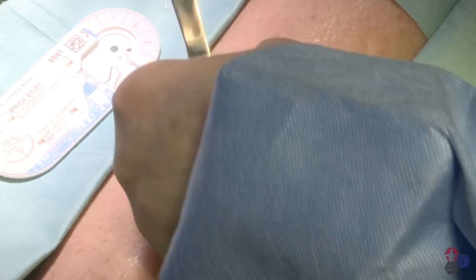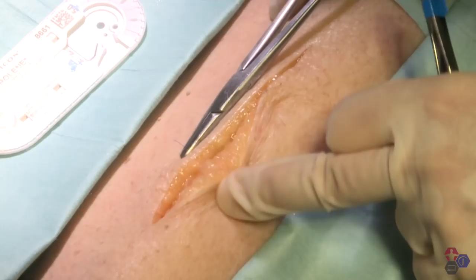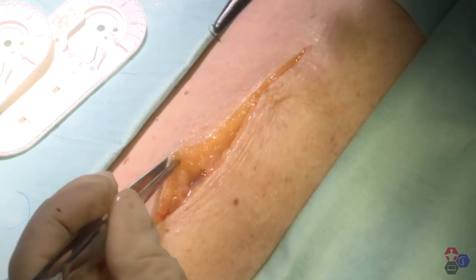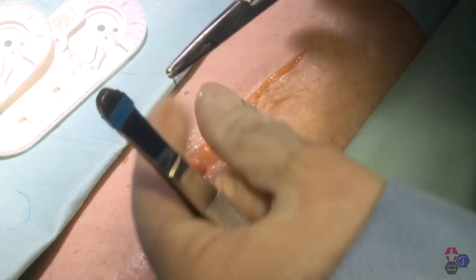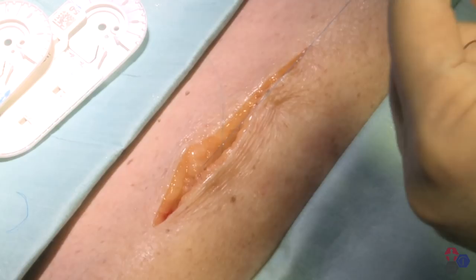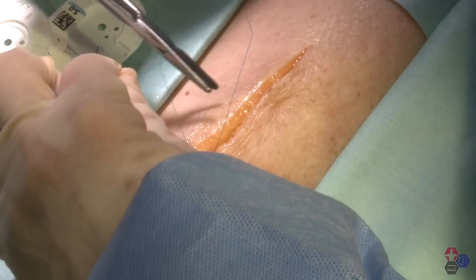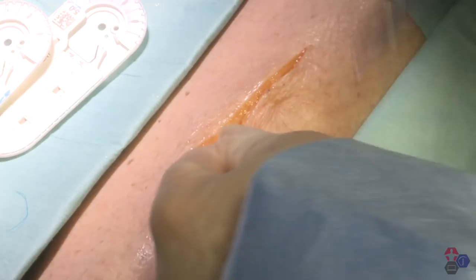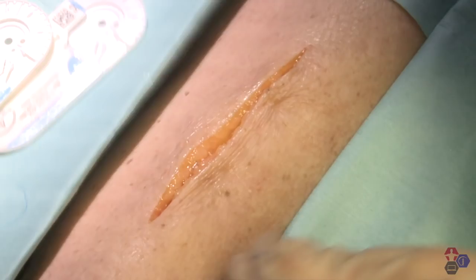You only need three throws on this. Cut the suture on top of that knot, and you can see it's already re-approximated the subcutaneous tissue. I would probably put another one in this location here. I'm going to close this space over here — start deep, come out superficial. Don't buttonhole the epidermis. Superficial to deep, keeping it all on the same side of the tie. Do our surgeon's knot, pulling those deep spaces together. Reverse locking stitch, one more for good measure. Once the knot is buried, you don't have to worry about it having very much tension on it, and you can see that I've re-approximated that deep space.